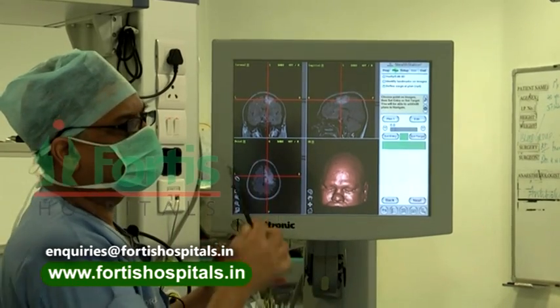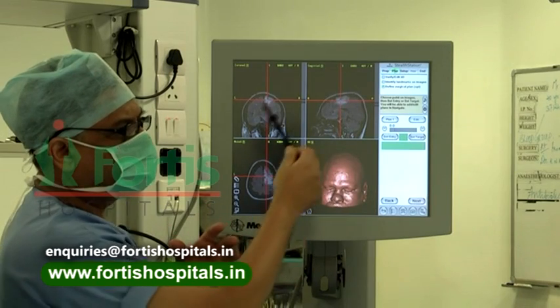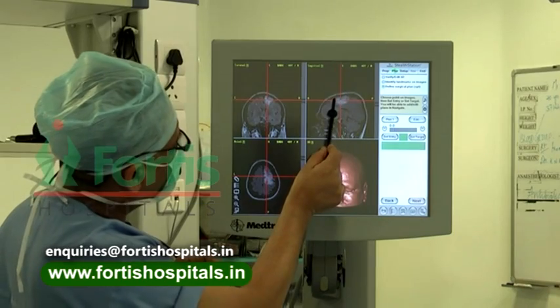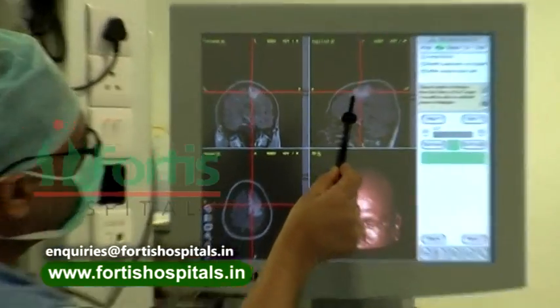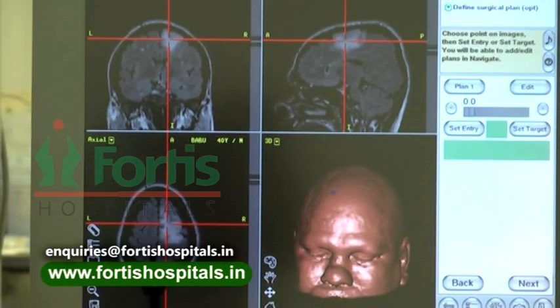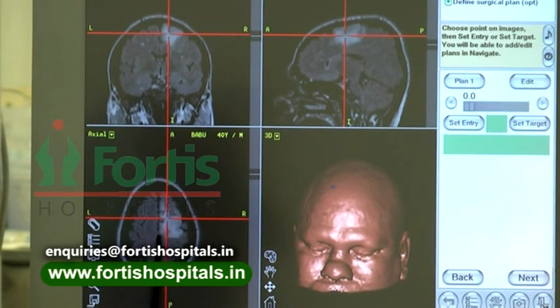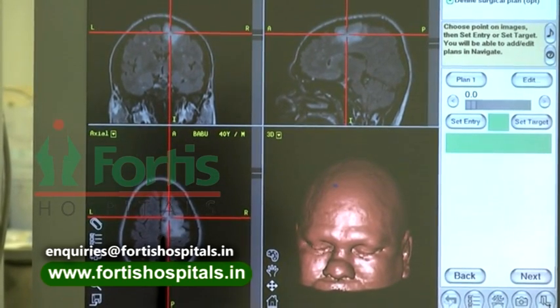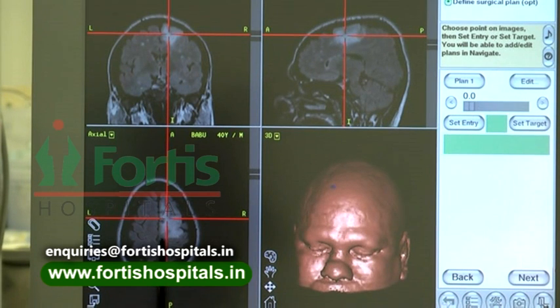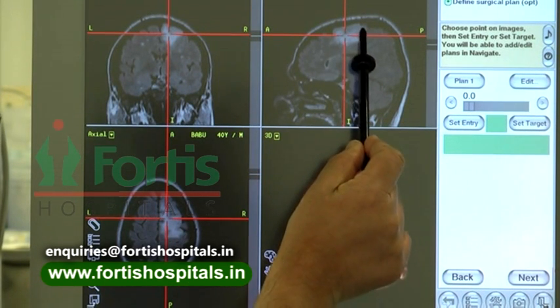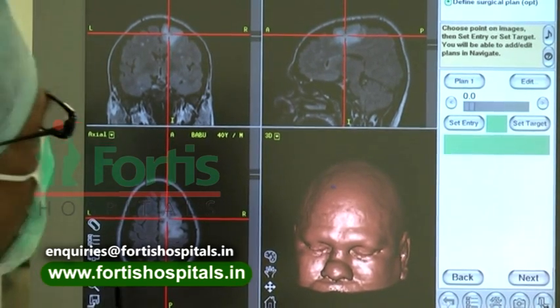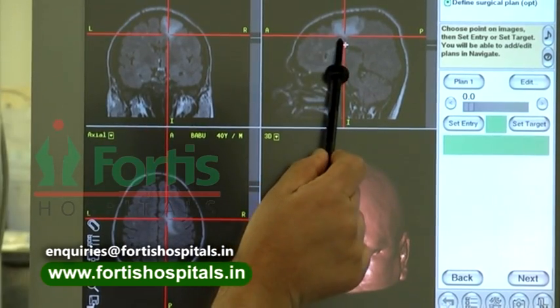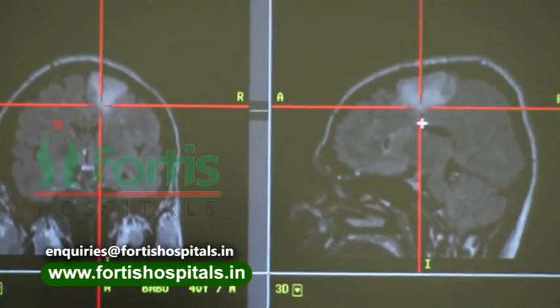The system can also give us a 3D picture of the whole tumor. In this particular case, the bright signal in the FLAIR sequence delineates the tumor, which is very close to the motor strip. The motor strip has been identified from the corresponding side. The tumor is abutting the motor strip on the right side in the pre-motor area. We are uncertain whether a portion of the rolandic gyrus is also infiltrated. It is therefore essential to preserve the motor cortex and its fibers. In real time, this system will help us track exactly where we are while operating — that is the purpose of neuro-navigation.